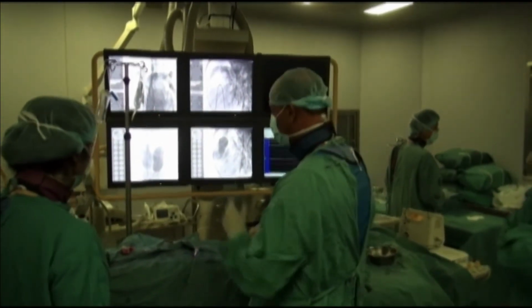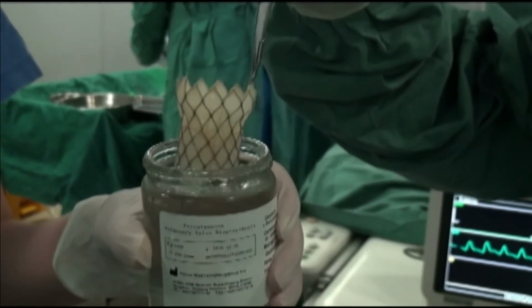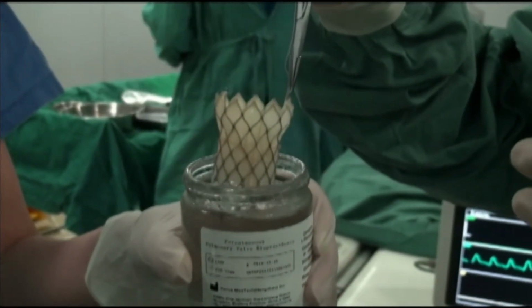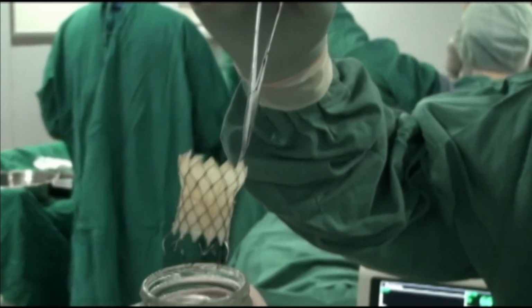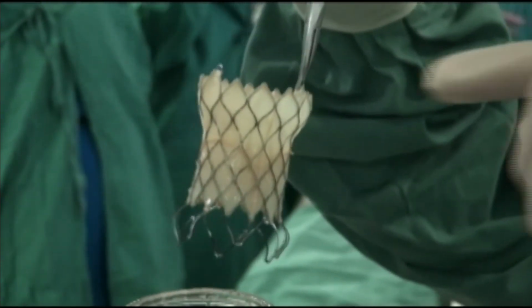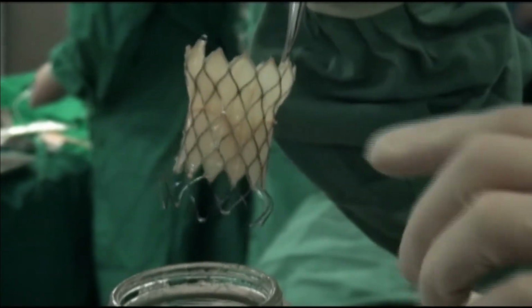So a 30 millimeter valve. This is our pulmonary valve, and the size of this valve is 30 millimeters, and the length of the middle part is 25 millimeters, and the two flares are 10 millimeters bigger than the straight part. And in the RVOT, this is the inflow, covered by the porcine pericardium, and this is uncovered. Don't stop the blood.